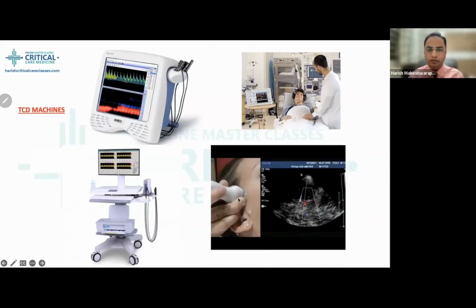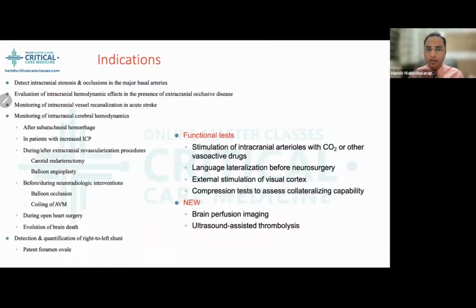Currently, the GE machine and Philips advanced machines give an option for doing transcranial Doppler with a specific probe. We have both options in our unit. We can do it with a continuous TCD machine, or intermittently with a regular ultrasound with an add-on probe for TCD. So these are the broad available options for TCD.